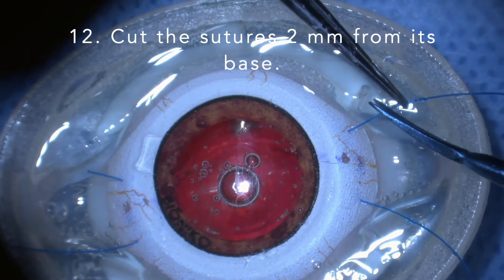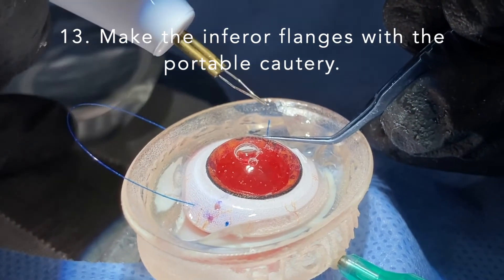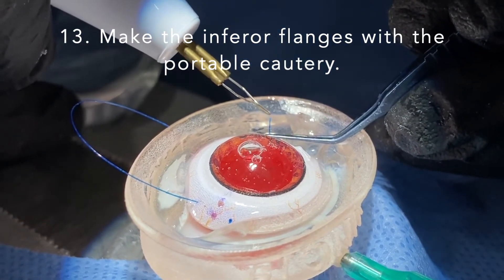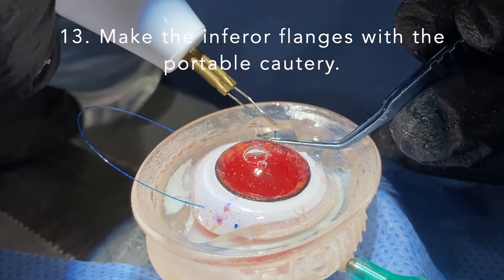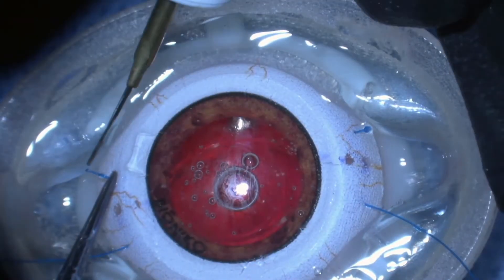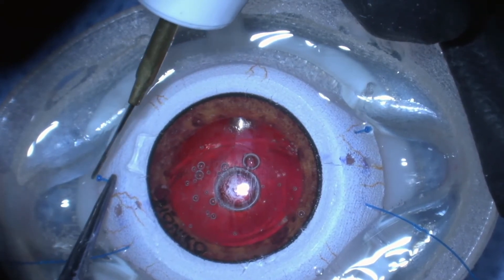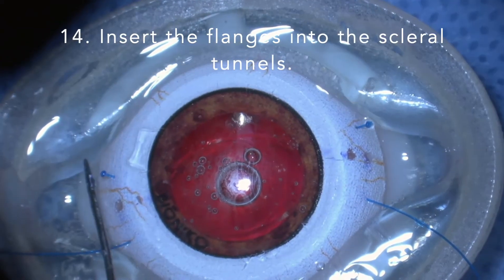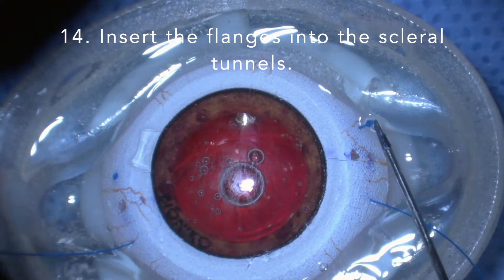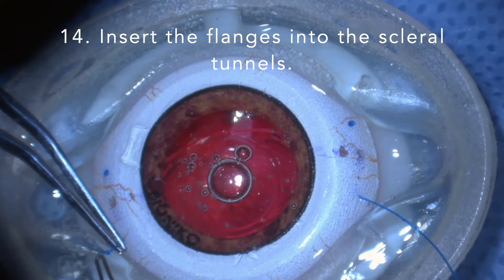Cut the sutures 2 mm from its base. Make the inferior flanges with the portable cautery. Insert the flanges into the sclerotomy tunnels. Let's do the other side.